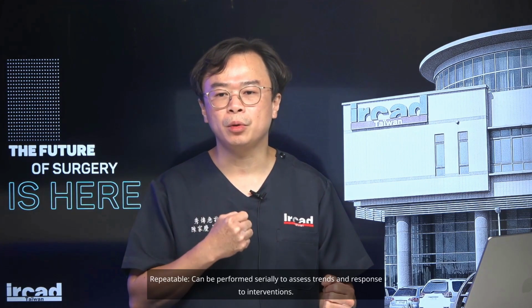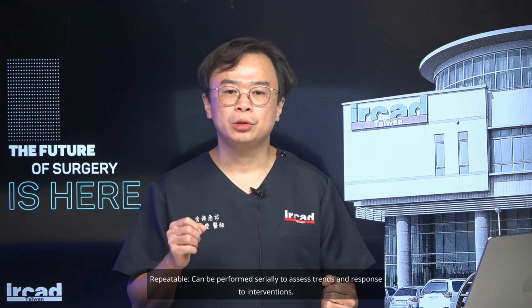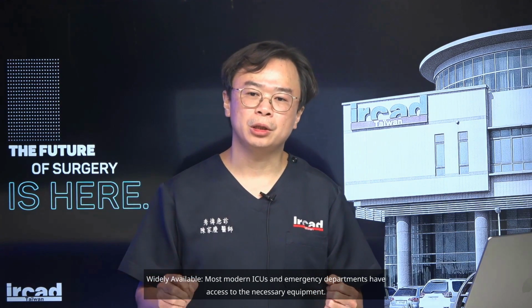1. Direct measurement. LVOT VTI directly reflects stroke volume, the parameter we're trying to optimize. 2. Non-invasive. Unlike pulmonary artery catheterization, it carries minimal risk. 3. Repeatable. It can be performed serially to assess trends and response to interventions. 4. Widely available. Most modern ICUs and emergency departments have access to the necessary equipment. 5. Physiologically sound, based on well-established principles of cardiovascular physiology.